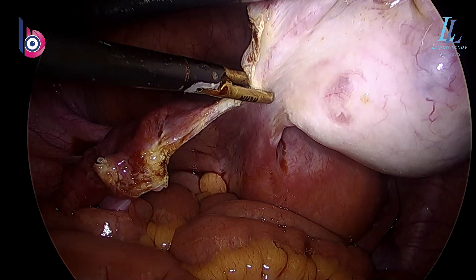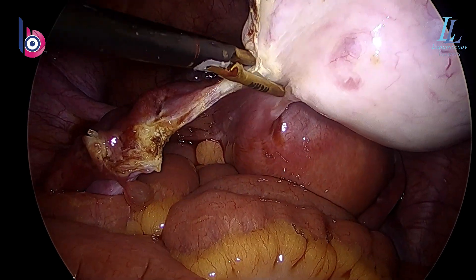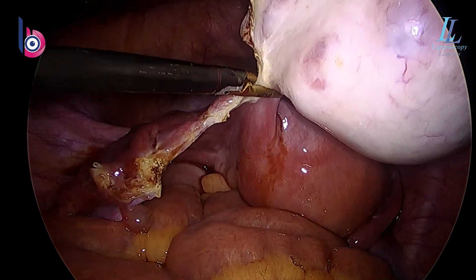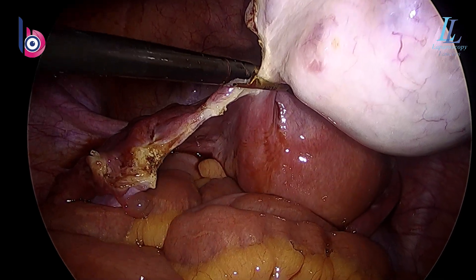Look how easy the surgery is — coagulating and cutting, not more than five minutes. In two minutes the dermoid is out, and the rest is extraction of the dermoid.